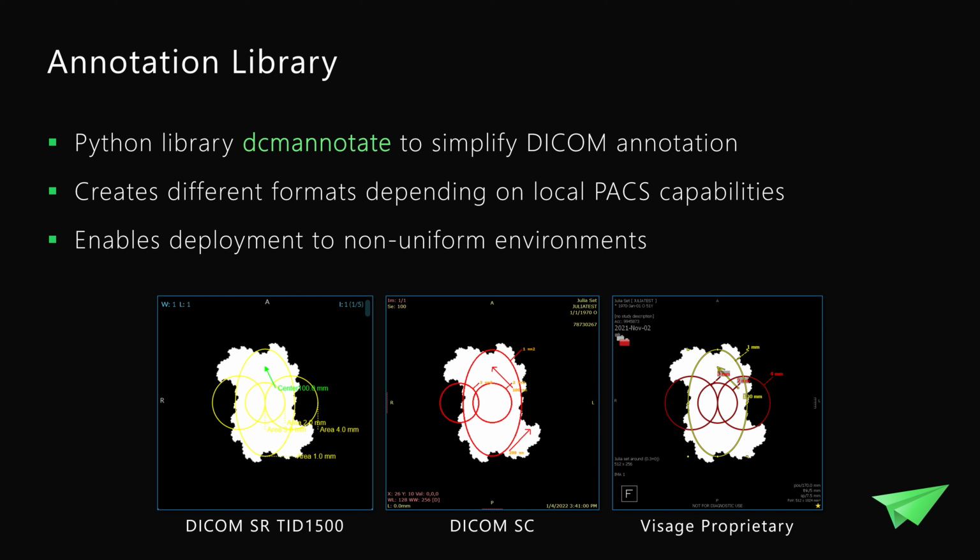So it can create annotations in the DICOM SR TID 1500 standard, which is supported by some of the newer DICOM viewers like OHIF. In our department, we are using a PACS by Visage, and therefore we are creating annotations in the proprietary Visage format. And then you can also create annotations as secondary capture DICOM images, so basically burnt in pixels, which can be used everywhere.